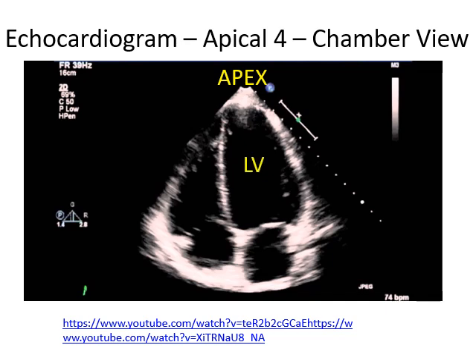This is the left ventricle, and you can tell because it's bigger than the right ventricle. This is the one that has to pump all the blood to the whole entire body. This is your right ventricle. This is your left atrium, and this is your right atrium. So it's giving you a pretty good view here.